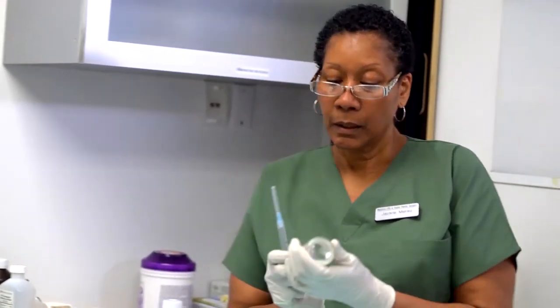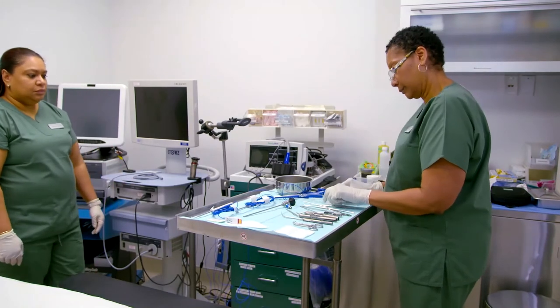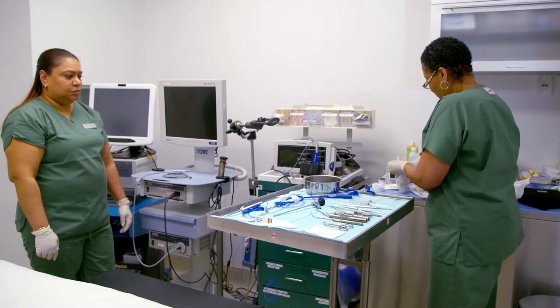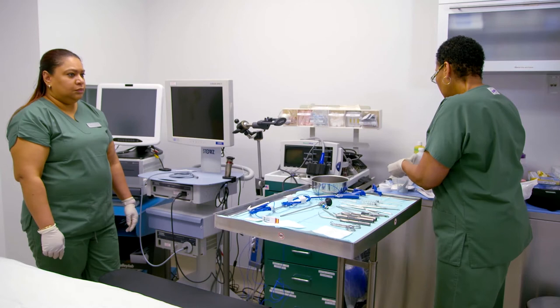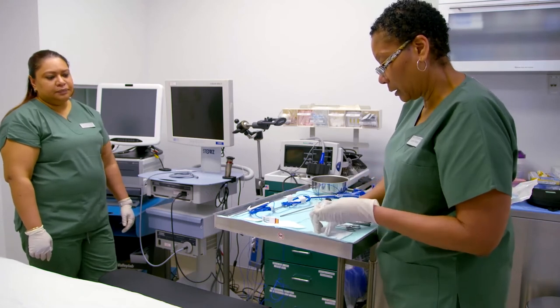So for Dr. Silva's numbing of the patient when they come into the room would be 2 cc's of 1% lidocaine and 1 cc of sodium bicarbonate, and I attach the needle onto it. My tray also has 6 pledgets. Also has a solution of lidocaine and pontocaine.